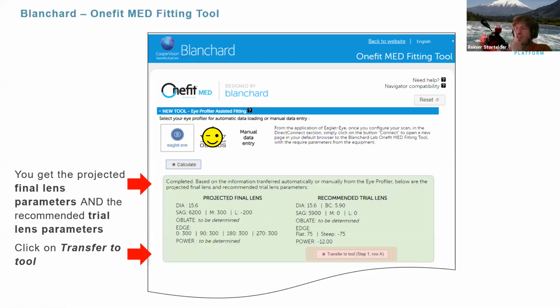This was too specific for this lens type, and therefore we could not calculate it. So the good thing about having the button is that it gives you more possibilities to customize the lens from the ESP measurement.